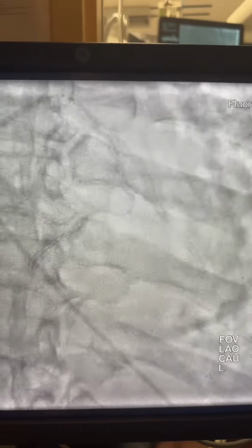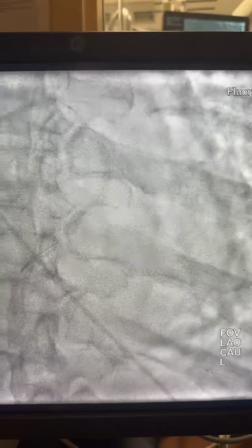Here is the angiogram after the 7 French. I see the flow still sluggish, so I did Pronto LP thrombectomy before advancing the other wire. You can't advance the catheter with 2 wires in a 6 French sheath or 6 French guide, so you have to do it with 1 wire. Did the thrombectomy, then we're going to wire the OM.